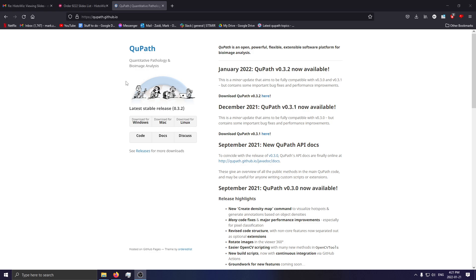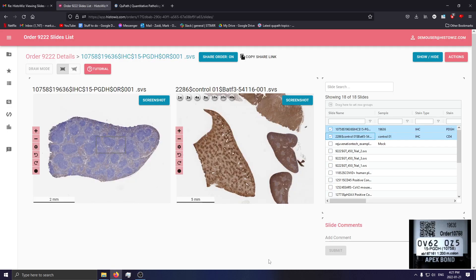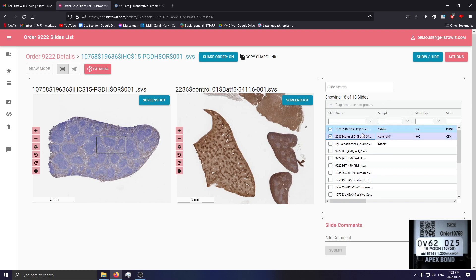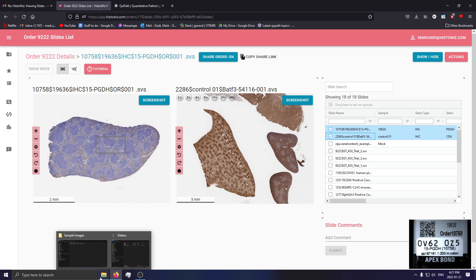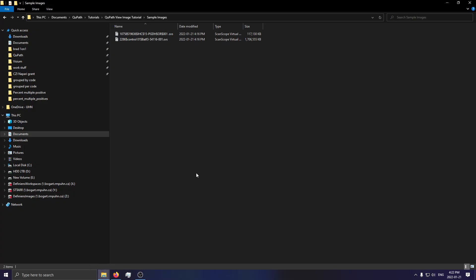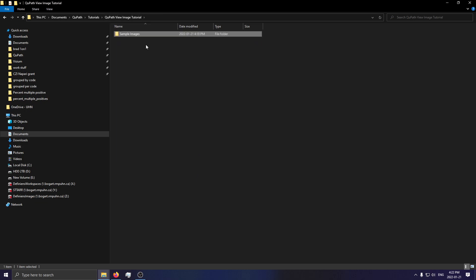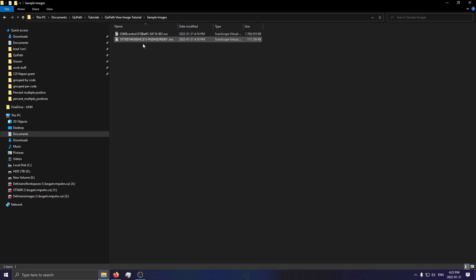The next thing you're going to need are images. I'm going to be recording this video using sample brightfield images from our publicly available repository. I've already gone ahead and downloaded these two images shown on screen. Once you've downloaded the images, the first thing you want to do is create a folder called "sample images" and just dump all of your images there.